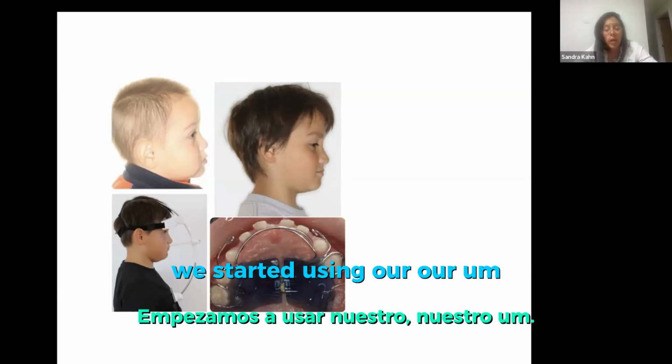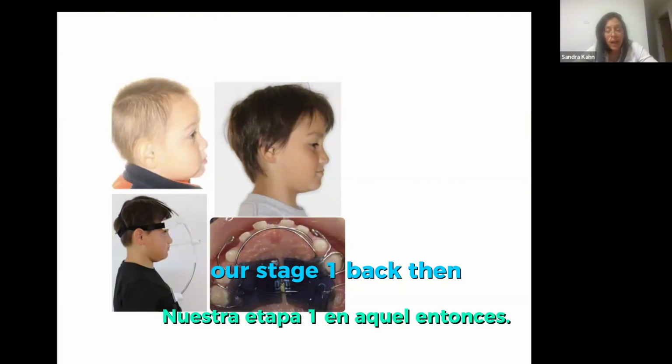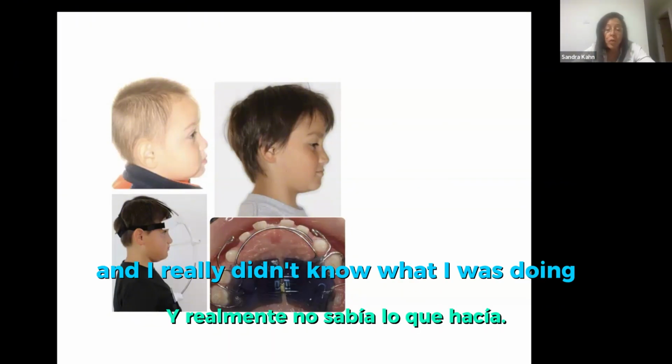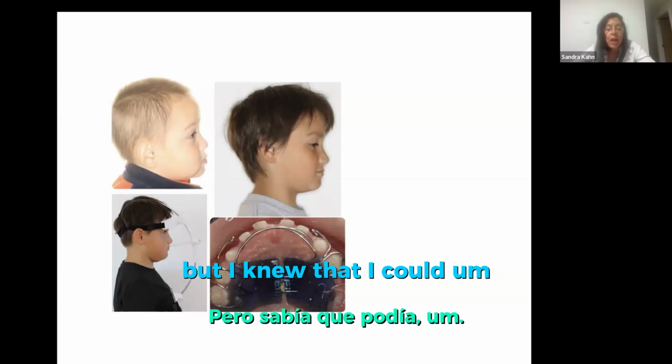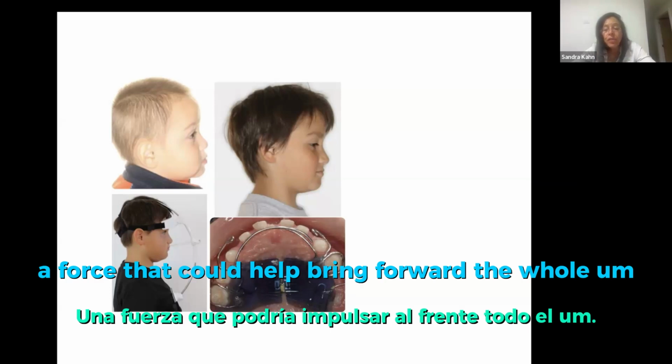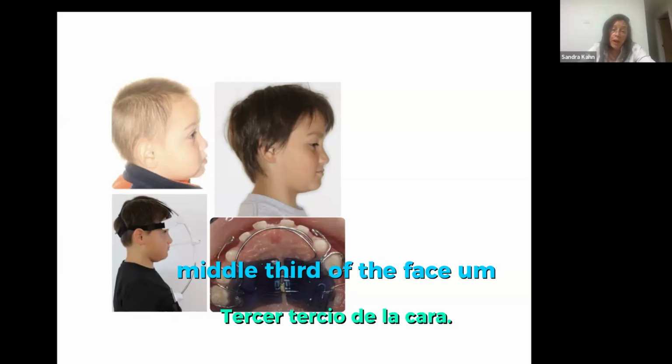We started using our stage 1. Back then, I would make all my devices, and I really didn't know what I was doing, but I knew that I could give the patients a vector of force that could help bring forward the whole middle third of the face.